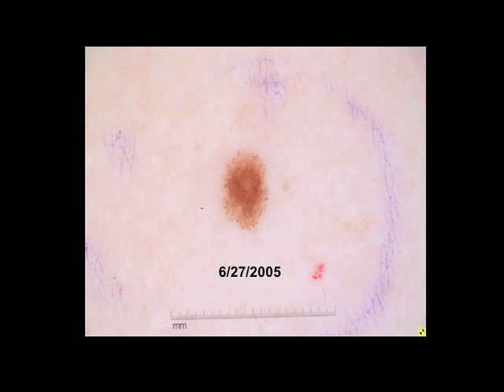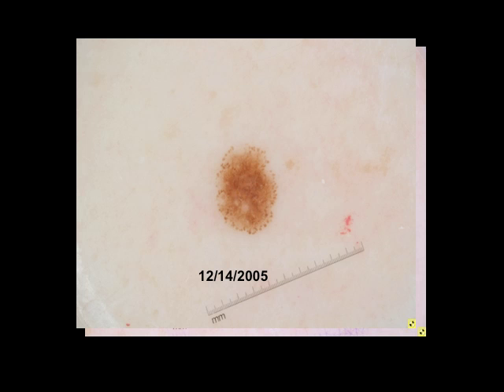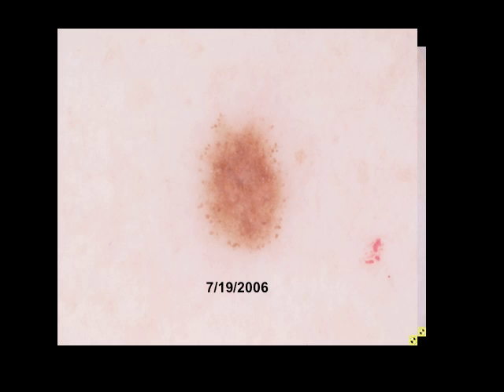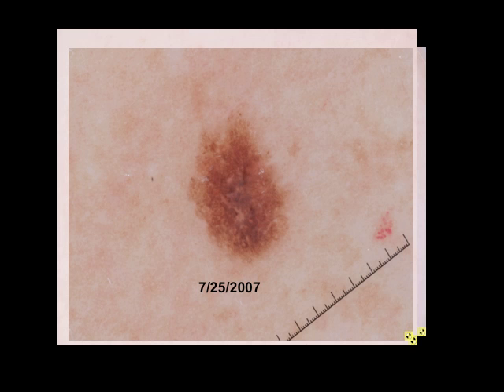Peripheral globules present around the entire perimeter of a nevus are indicative of an actively growing nevus. If such nevi are sequentially followed over time, they will symmetrically enlarge, the globules will become sparser, and eventually the nevus will enter a stage of senescence — at which point the globules will no longer be visible, and the nevus will manifest a reticular or homogeneous pattern.